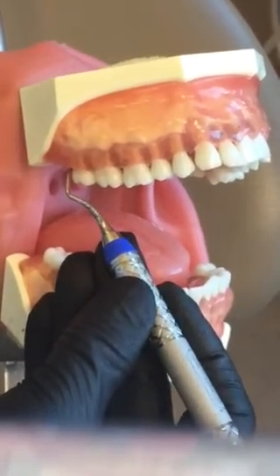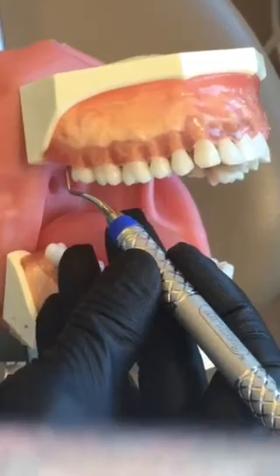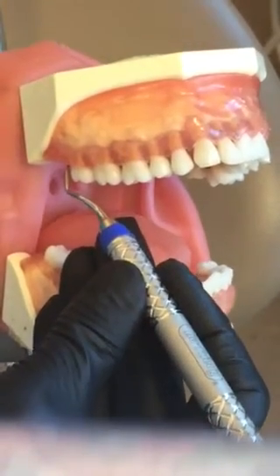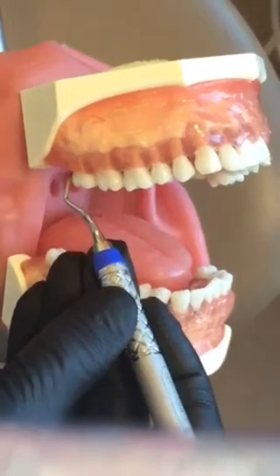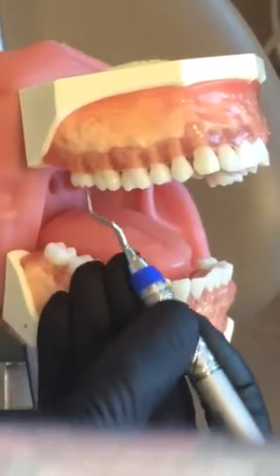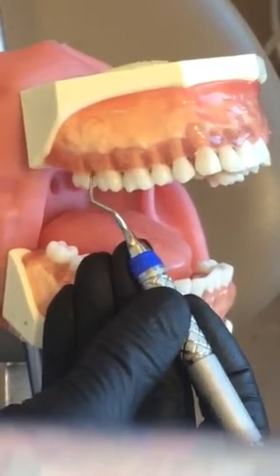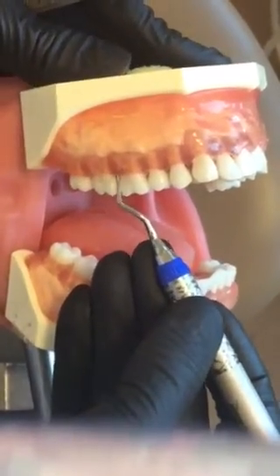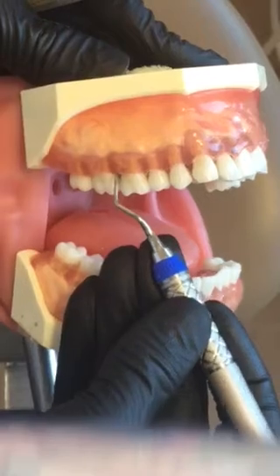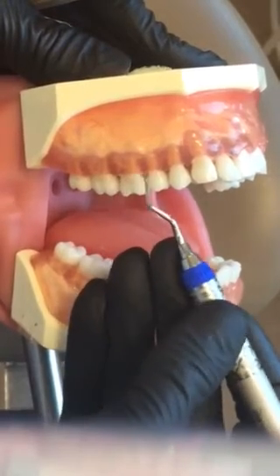You're going to start at the distal line angle. You will close the blade upon insertion to get to the base of the pocket. Then just stand back up on your fulcrum and do distal line angle and around to the distal. You can do that with each tooth — distal line angle into the distal.